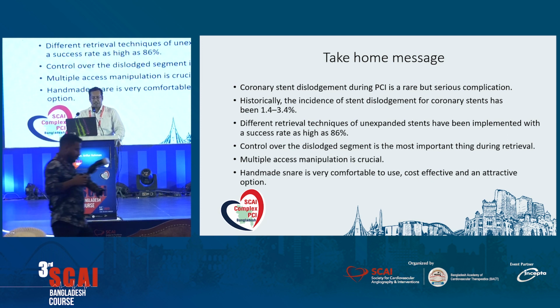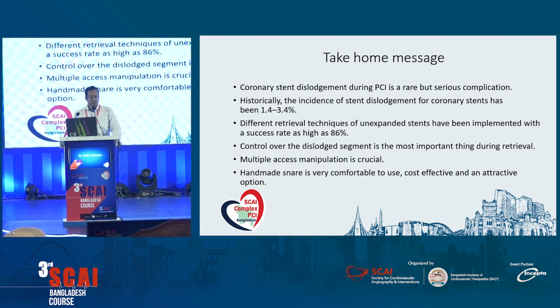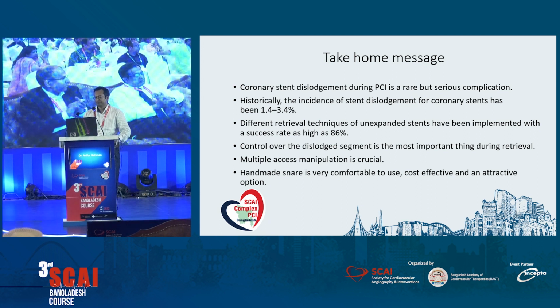And multiple access manipulation is crucial. So handmade snare is very comfortable to use. It is a very cost effective and attractive option for removal of this dislodged stent. Thank you. Thank you, Dr.